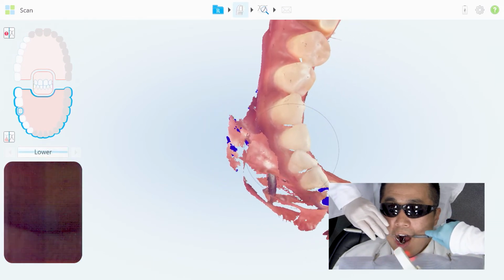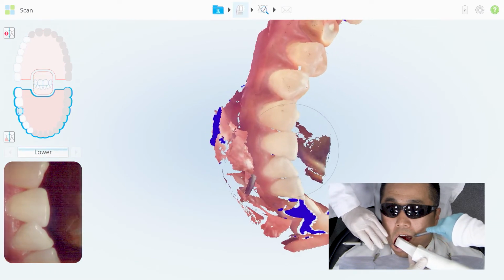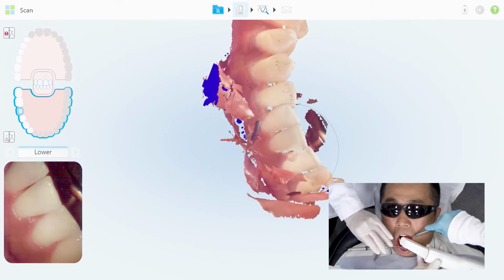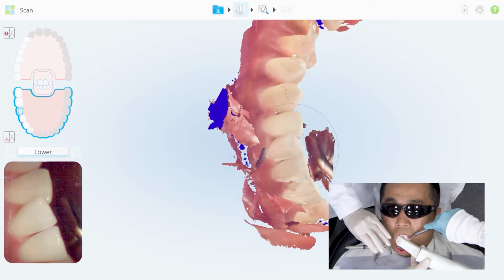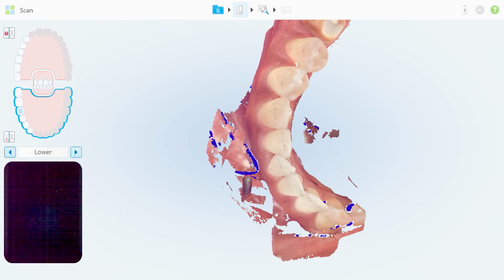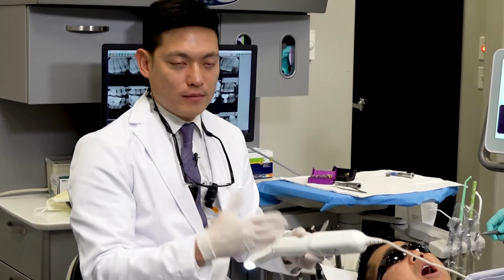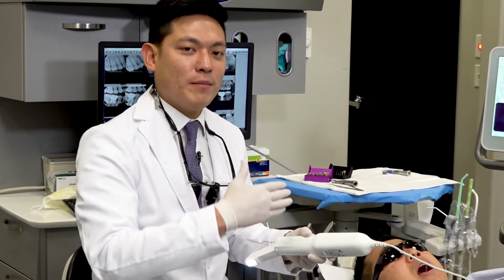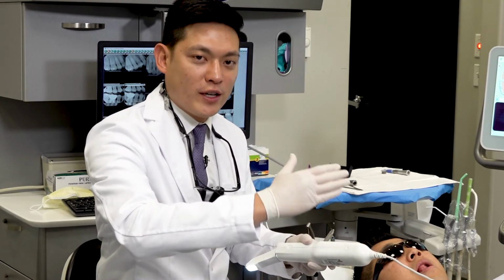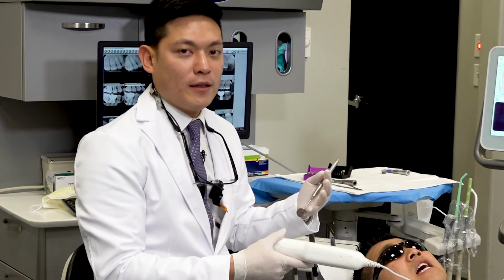So once you rotate to the facial, you start off at the incisal and then slowly build in those facial areas. That will allow the system a chance to build those areas in correctly, instead of just going straight to the facial without it really understanding how to align that data. So as you work your way toward the anterior region for those full mouth scans, you want to make sure you go slowly, but also build in this new data to the digital model slowly. So slow rotations, light rotations from the incisal, and again, analyze the model as it generates.